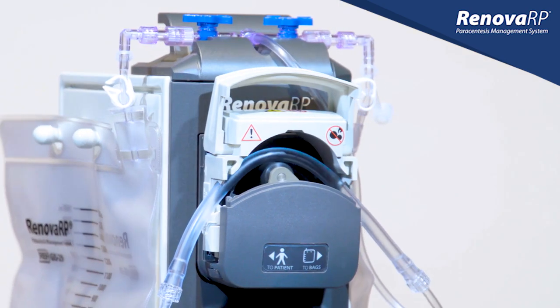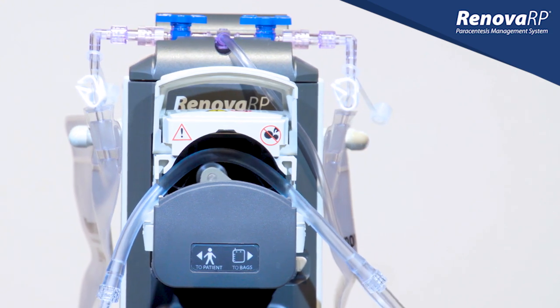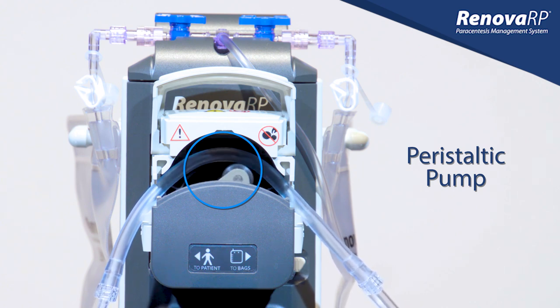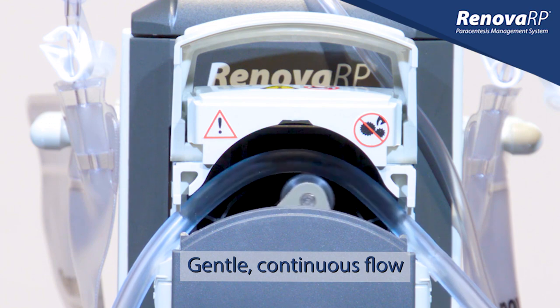Many of these benefits, including its efficiency and adjustable flow rate, come from the mechanism that drives the device — a peristaltic pump. Peristaltic pumps are fairly common in the medical setting and can be found in such devices as infusion pumps and dialysis machines. The Renova RP Pump employs this same peristaltic mechanism to draw ascitic fluid from the body with a gentle, continuous flow.